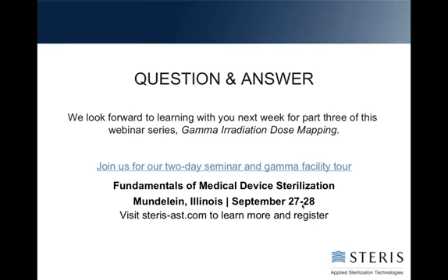That is your choice, as long as your dose is over the amount needed to make your sterile claim based on your validation. So augmentation is, for example, say you got 2 positives on your sterility test when you were only allowed 1. Or better, since you can do a confirmatory test, let's say you got 3. There are calculations for determining how much more dose you would have to give to that production batch to assure that the sterility assurance level was still met while you're investigating the cause of the increased bioburden.